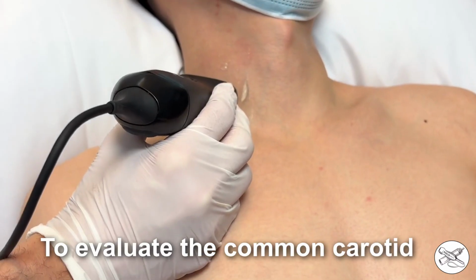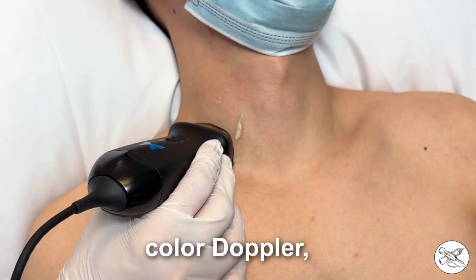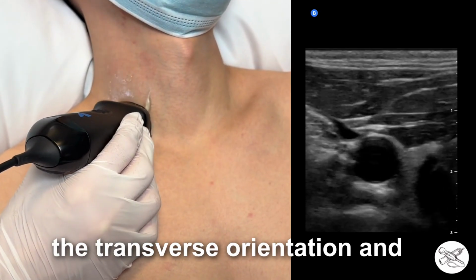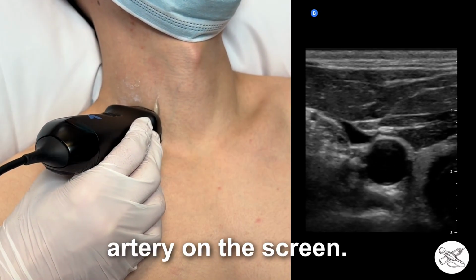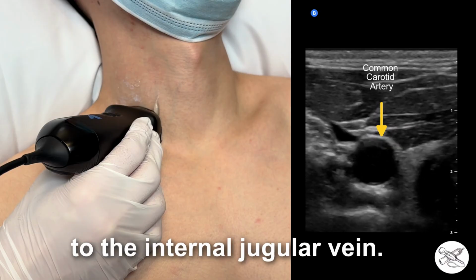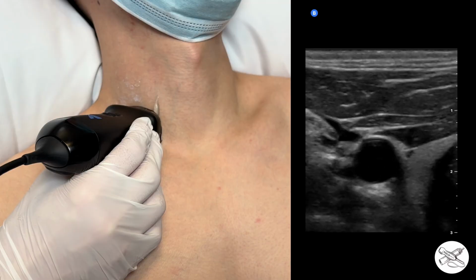To evaluate the common carotid artery blood flow with color Doppler, start by placing the ultrasound probe just above the clavicle in the transverse orientation and centering the common carotid artery on the screen. The common carotid artery usually sits medial and inferior to the internal jugular vein.